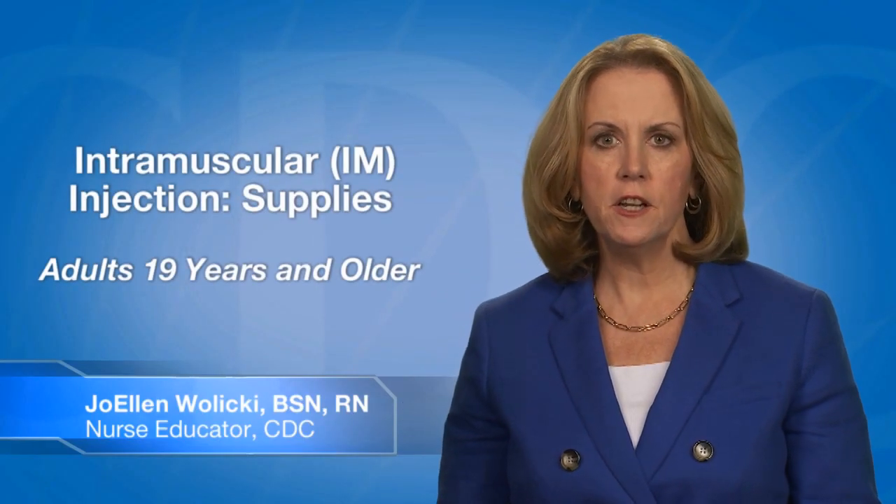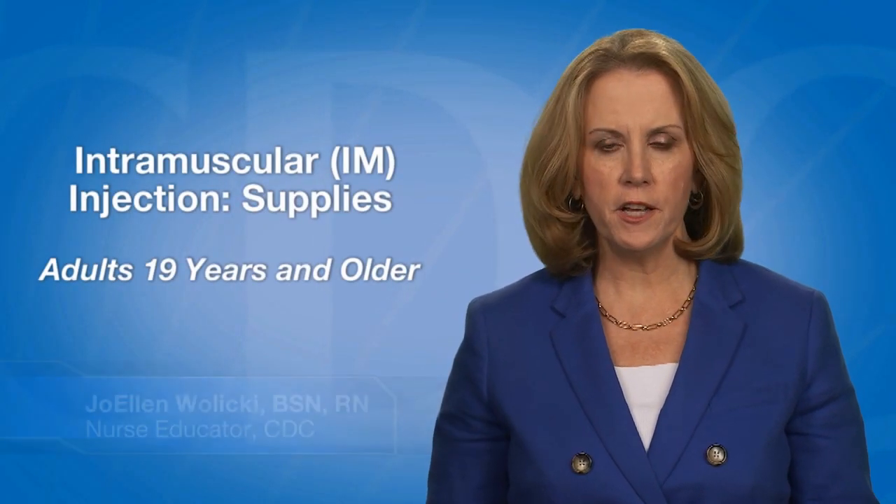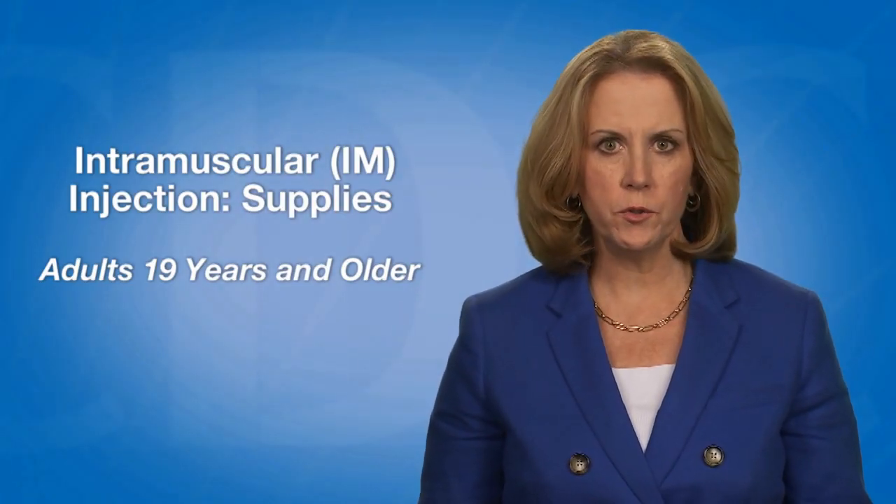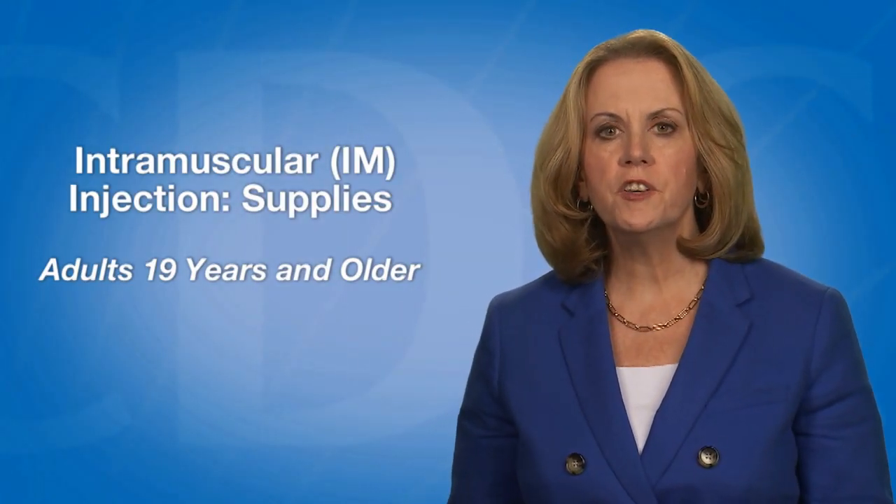In this video, I will describe how to select the equipment needed to prepare a vaccine for an intramuscular injection for adults 19 years of age and older. This route is abbreviated IM.